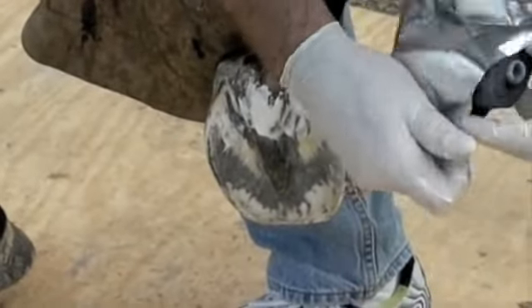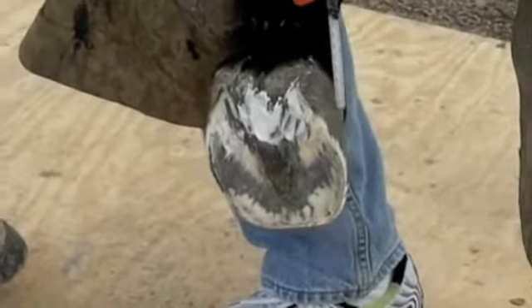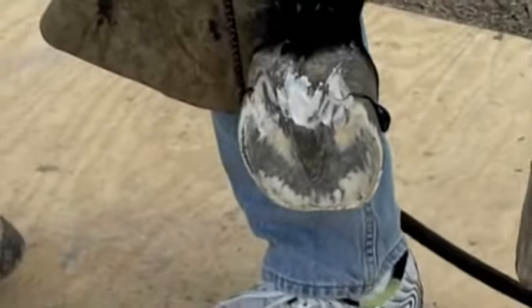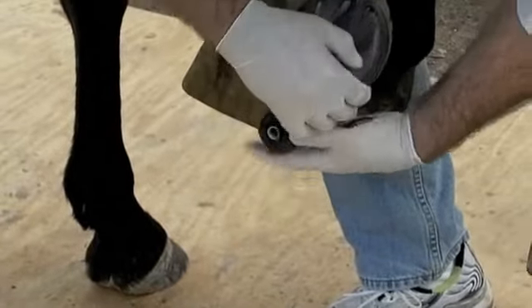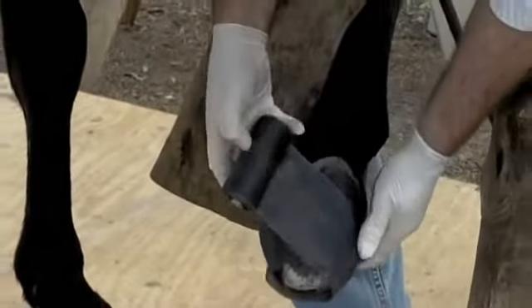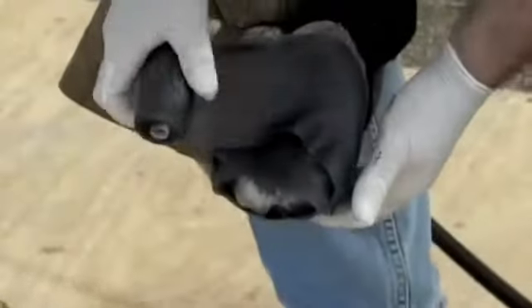As always, make sure you have everything ready — you have the pouch open, you have your Equalox or Adhere ready — and then apply Equalox or Adhere mid-wall from heel to heel. If you've got a more active horse, I recommend using Equalox and running a bead from heel to heel mid-wall. Very important that you apply a cast dry when you're gluing it.